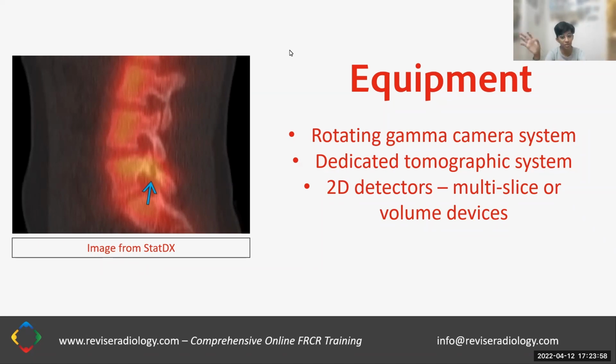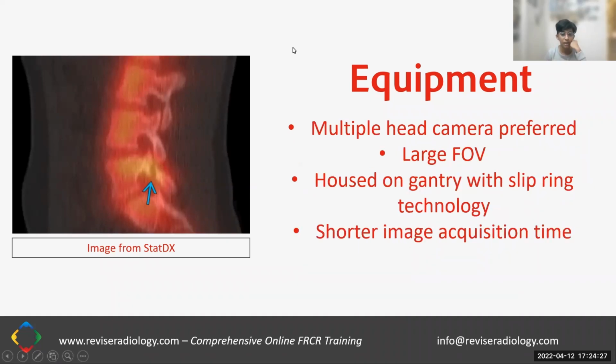They have a large field of view, capturing multi-slice information and imaging a large volume of the patient's body at the same time. If you want to understand how this kind of imaging works, you need to review concepts related to multi-slice CT imaging. I think we did an MCQ session on that on Monday, so you can refer to that on the dashboard if you're interested. I think we'll also be doing sessions on multi-slice CT imaging soon.